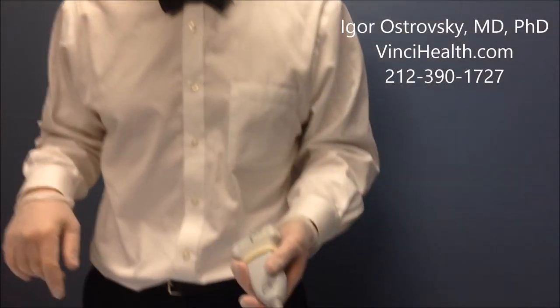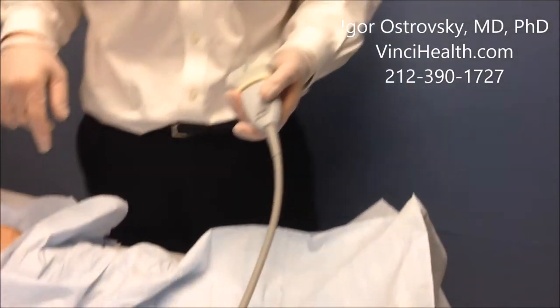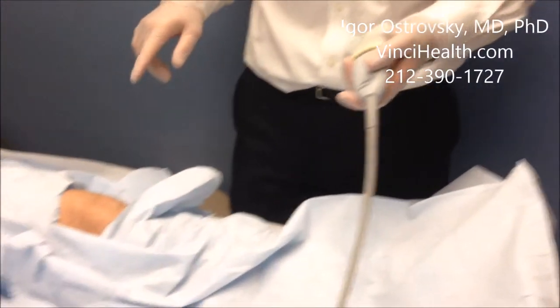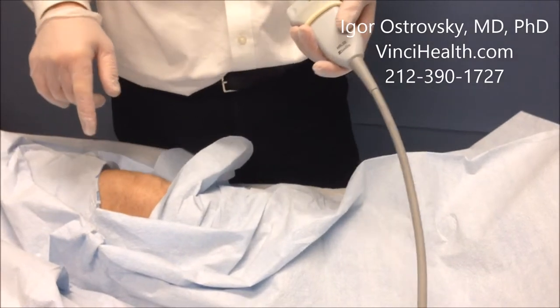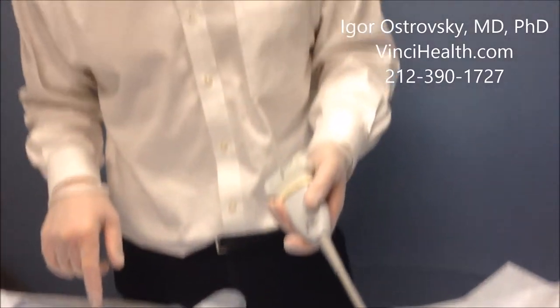Today I will do an injection of hyaluronic acid into the knee joint for a patient who suffers from osteoarthritis of the knee. 20 million Americans have osteoarthritis.